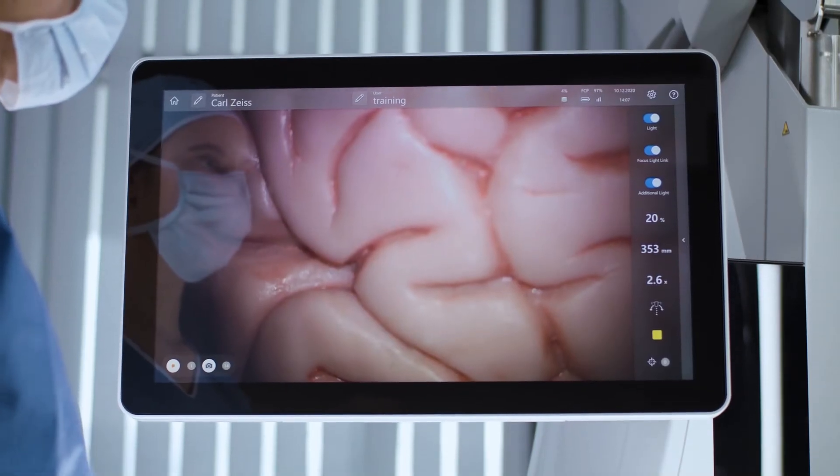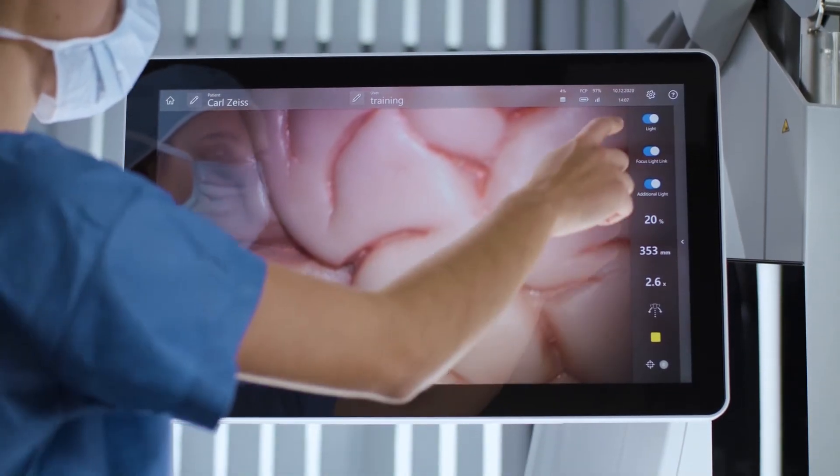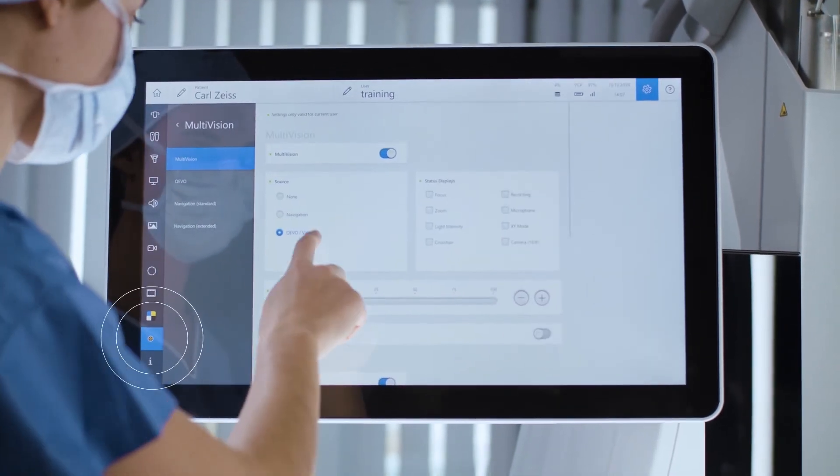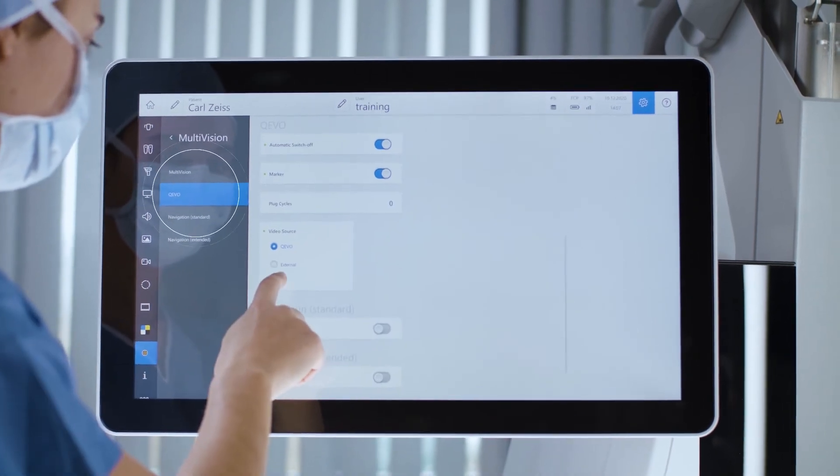To activate the input of Zeiss Convivo Surgical Workplace, press Settings, select Multi-Vision, select QEVO and choose Video Source External.